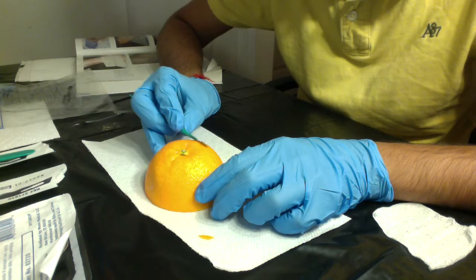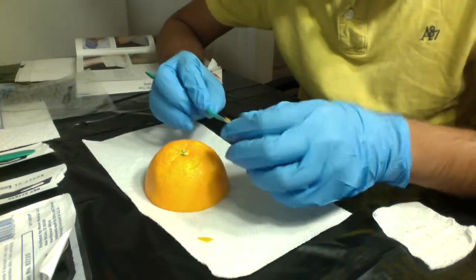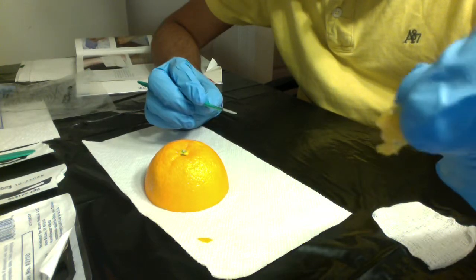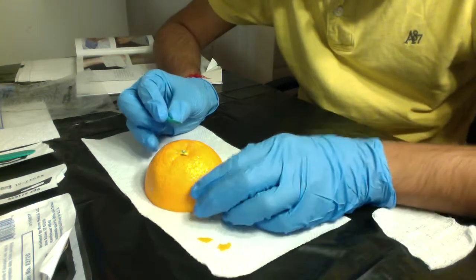The forearms are supported, and most of the movement is coming from the wrist and the fingers, the sawing motion. Very thin tissue, very transparent.